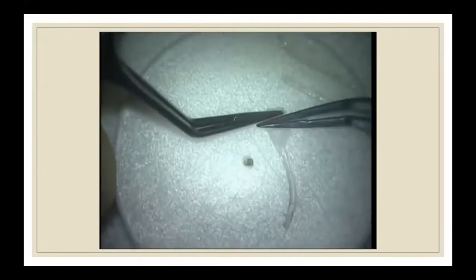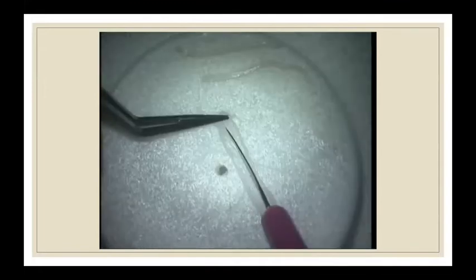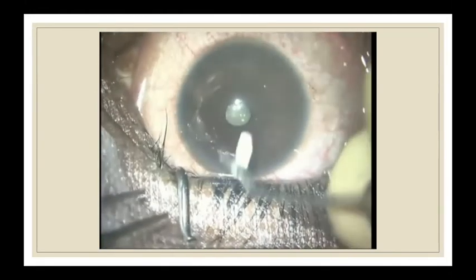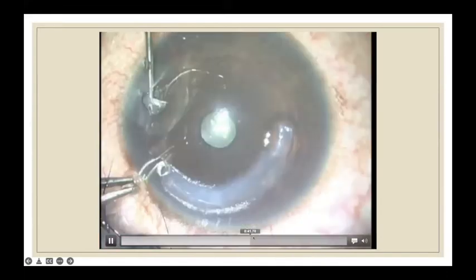And also, if you want further sizes, you can split the graft into further sections, and really it is not very difficult to just hold it there and draw the knife down so that you can get different sizes of tissue. Again, the femtosecond laser dissected channel is being opened up by the glide dissector, and the segment is being implanted in.